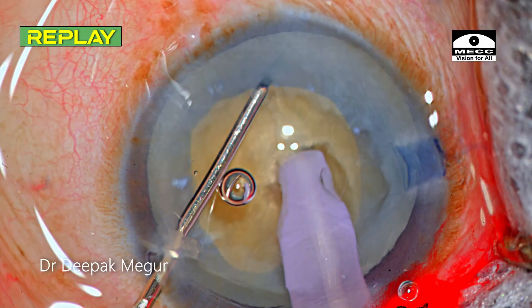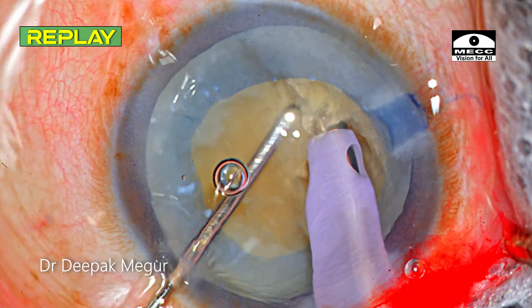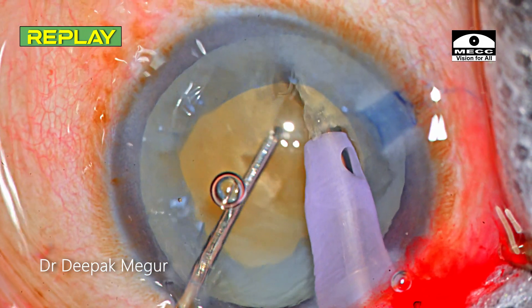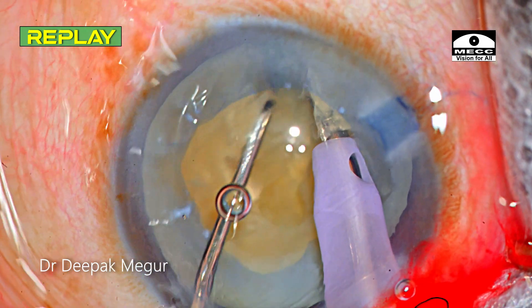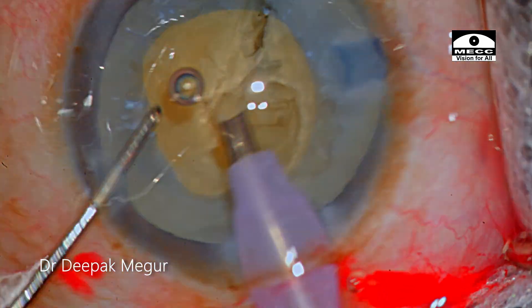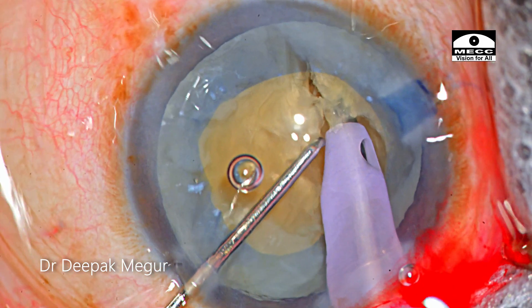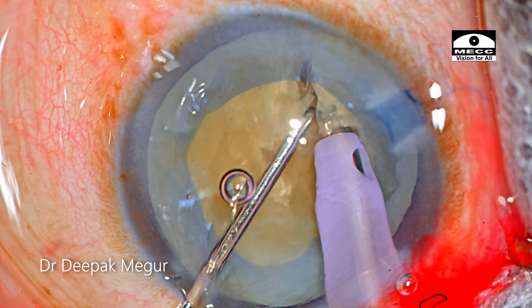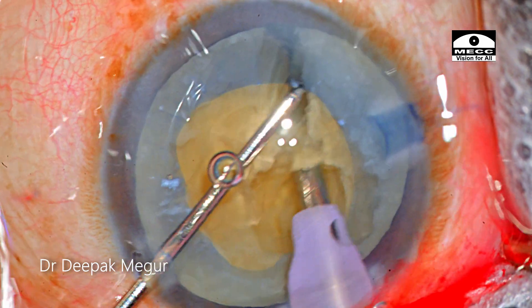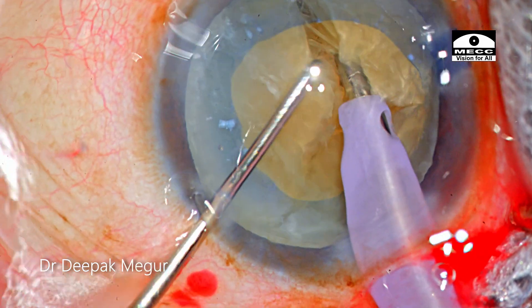An important point to note is that the chopper should never touch the rhexis margin. I'm very conscious about this because the rhexis is not very large. Hence I'm not very aggressive in lateral separation movements. Instead, I place the chopper deep inside and then separate, which helps minimize any stress on these already weak capsules — these are long-standing cataracts and the capsules will not be very healthy.